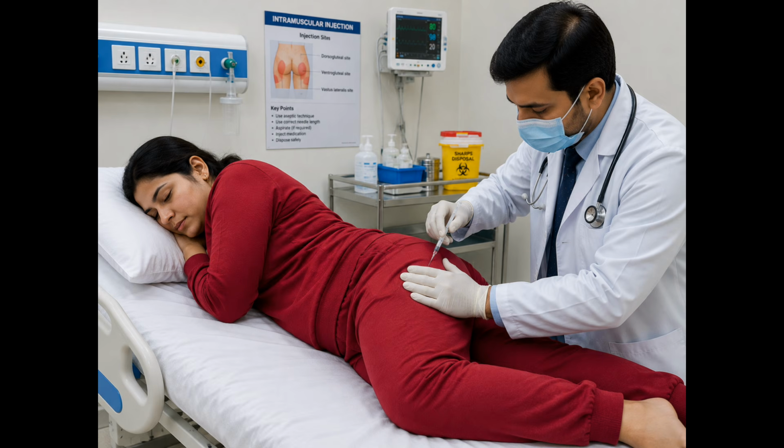Hand hygiene is one of the most important steps in infection prevention. The healthcare professional washes or sanitizes their hands thoroughly before handling equipment. All required supplies, including the prescribed medication, sterile syringe, appropriate needle, alcohol swabs, gloves, gauze, and an approved sharps disposal container, are prepared on a clean surface using aseptic technique.